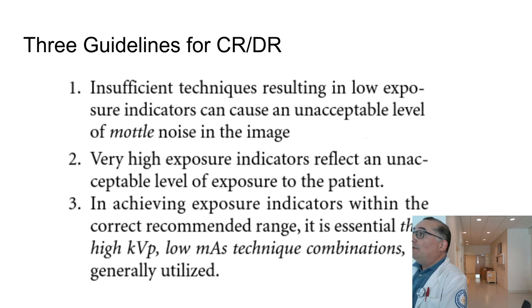So for example, if you did a hand at 2 mAs and it looks good, that's fine. If you do a hand at 20 mAs, that's also going to look good. You probably have to do the hand at around 200 mAs before you actually see a noticeable difference in the actual image. But before you ever get to that, let's go back to the 20 mAs, which is still a considerable overexposure, right? You know, 10 times what you should have used. The only way to see it, in quotes, right, is by your exposure indicator, right? Otherwise, it looks good.